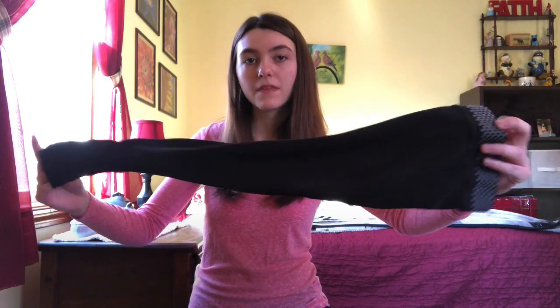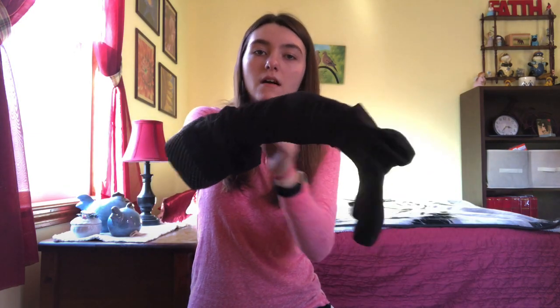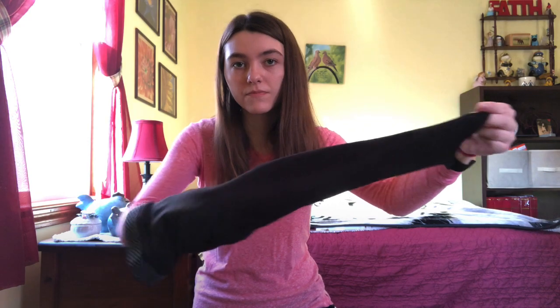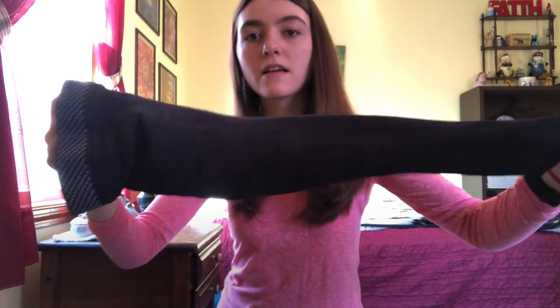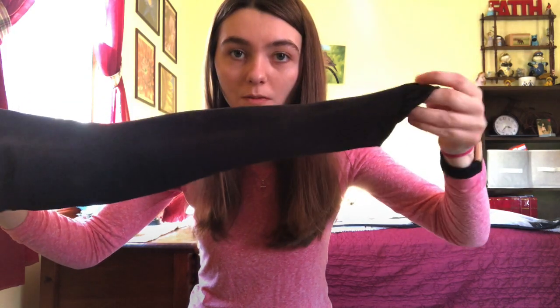So the first thing I do is I make sure that the stocking is inside out. As you can see, you can see the silicone band right here. The next thing that I do is I stick my hand through, just like this, all the way through to the other side. Now my fingers are sticking out in the foot part. Now I'm going to grab the heel part with my other hand and I'm just going to carefully and gently pull this through. So now this is what it looks like — you have your silicone band here and you have your heel part of your stocking here.